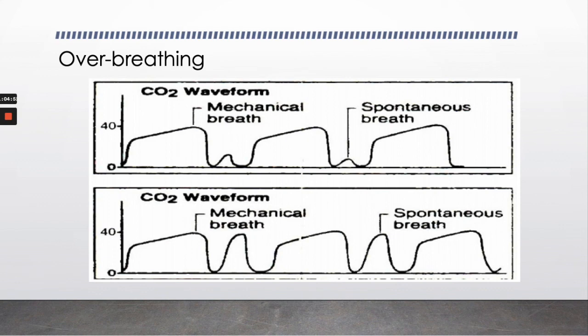If you want to let your patient spontaneously breathe after you've intubated them, that's totally fine. You just use some narcotics and some gas, to get them down and not paralyze them, but just keep them down so they're not moving, but they're breathing on their own.